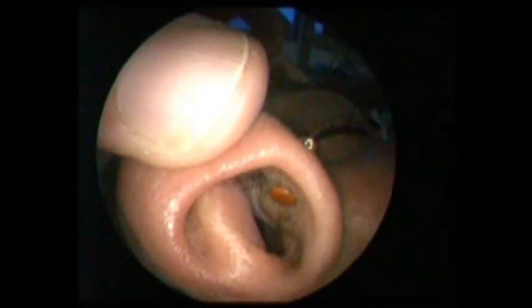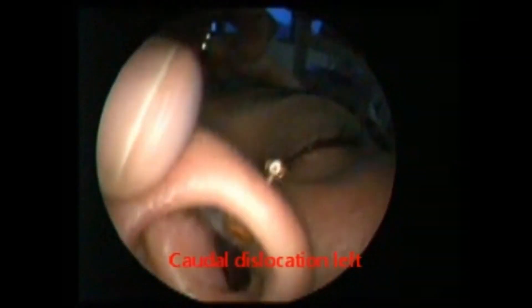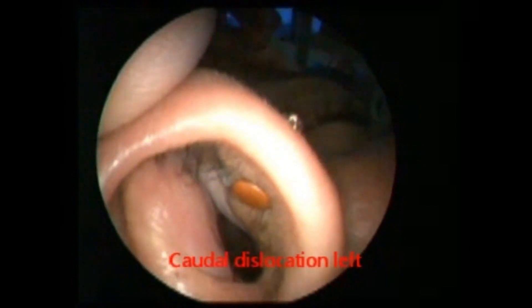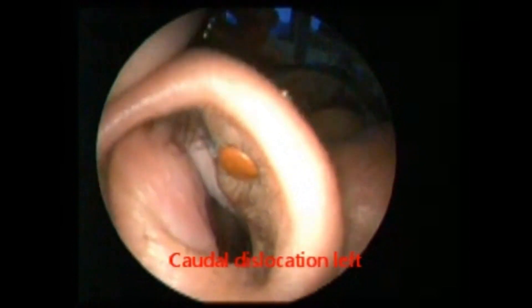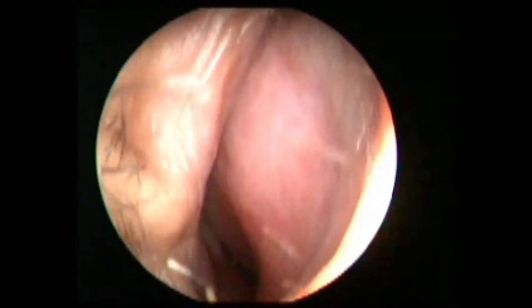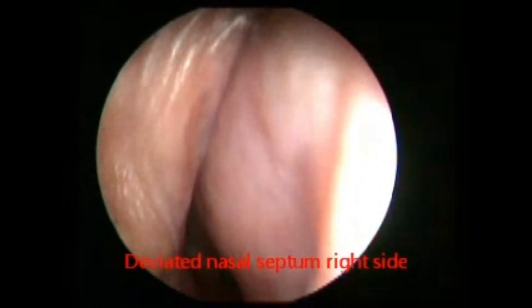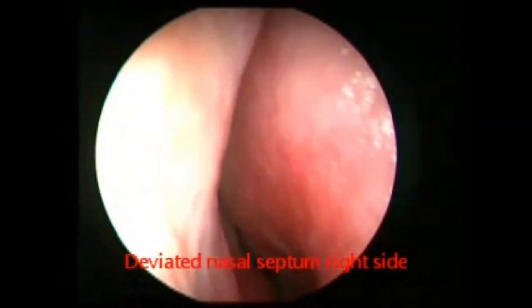The video we are showing here is a diagnostic nasal endoscopy. As you can see just starting, there is a caudal dislocation on the left hand side. This is mainly a cosmetic thing, and the patient has an associated right septal nasal deviation almost touching the lateral wall at the area of the middle turbinate.